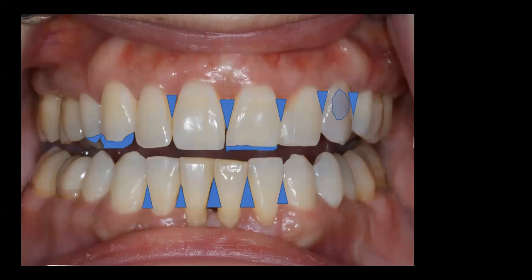Correct. So what I'm saying is, this case, she's ready because she wants all her black triangles eliminated. She wants to have her teeth done with the Bioclear method. We're going to add the missing incisal edges. We're going to injection overmold 20 teeth. That's a 300,000 rupee case.